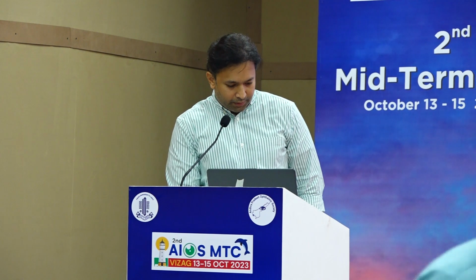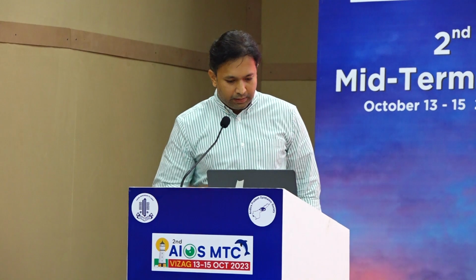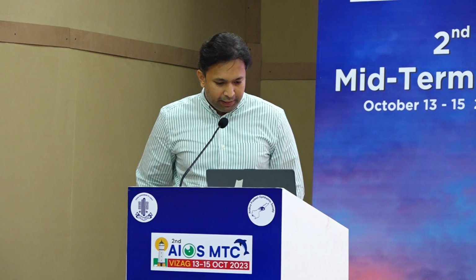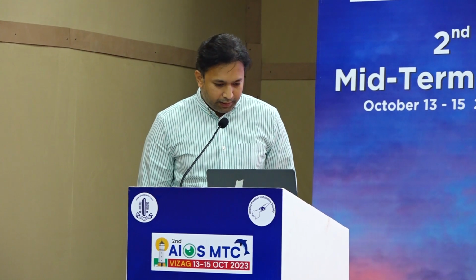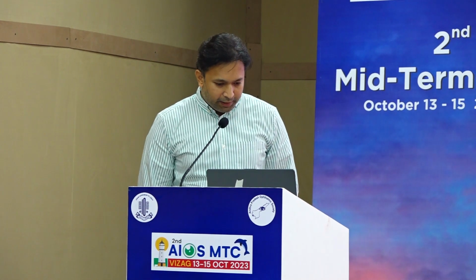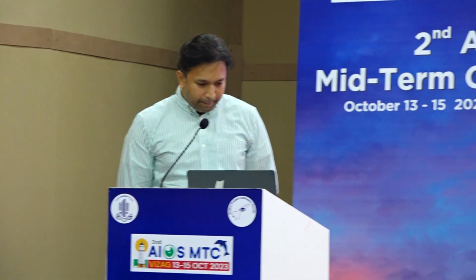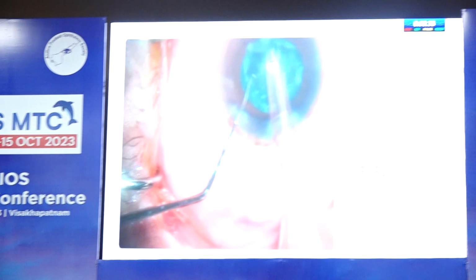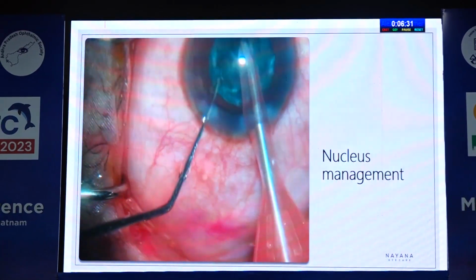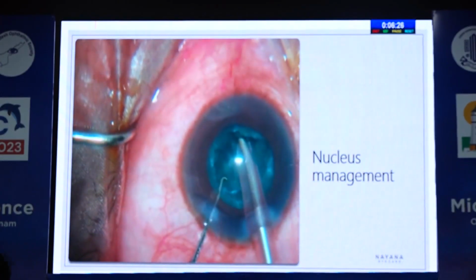This is a case of phacoemulsification. It's a grade 1 to grade 2 nucleus. Right from the start of surgery, I was unable to create a trench due to the soft cataract. I made a crater, and I found that the nucleus wasn't rotating properly. So at some point of time, there must have been a small rent, and I'm still trying to rotate the nucleus. Nothing is going as per plan.